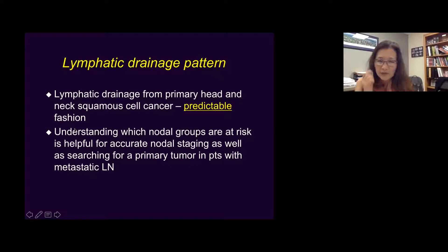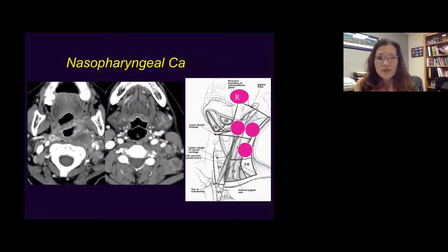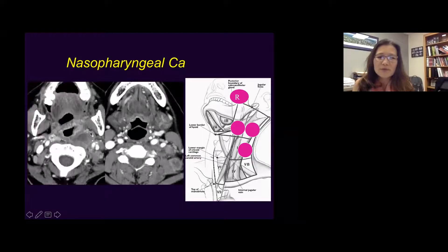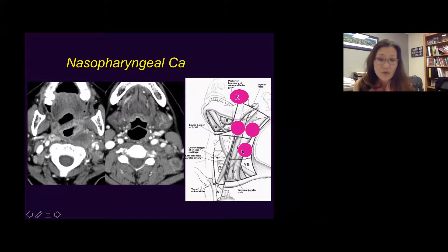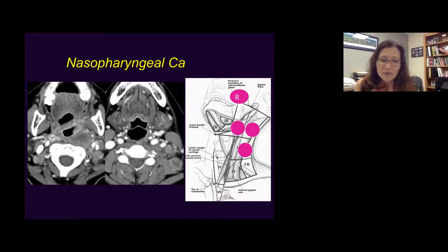Starting with nasopharyngeal cancer — here is a patient with nasopharyngeal carcinoma with large retropharyngeal lymph nodes. A little farther down, there's a level 2 lymph node because it's medial to the SCM. And this one is more posterior, making it a level 5 lymph node. So retropharyngeal, level 2, and level 5 are very common zones where nasopharyngeal cancer can spread.